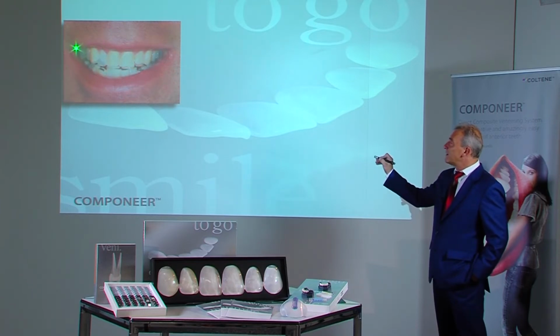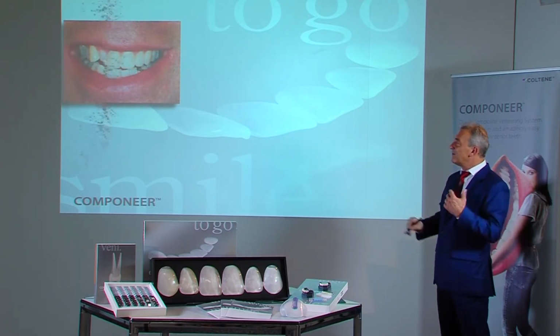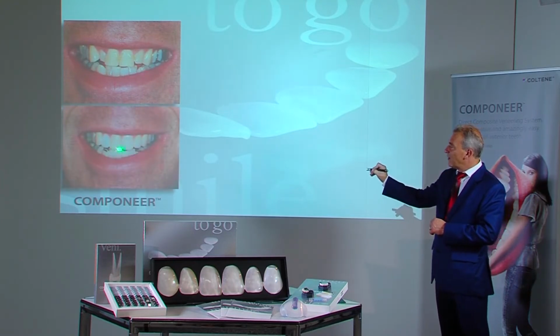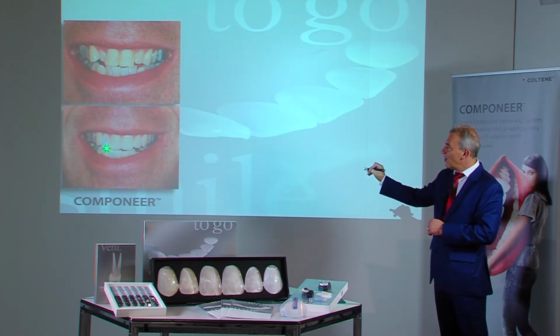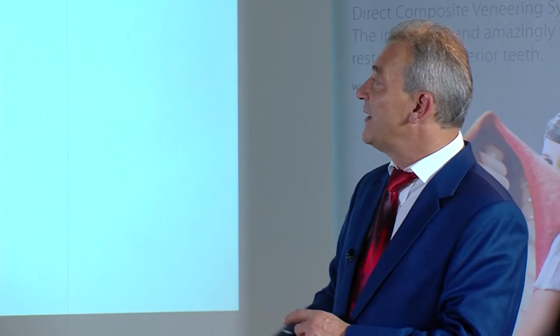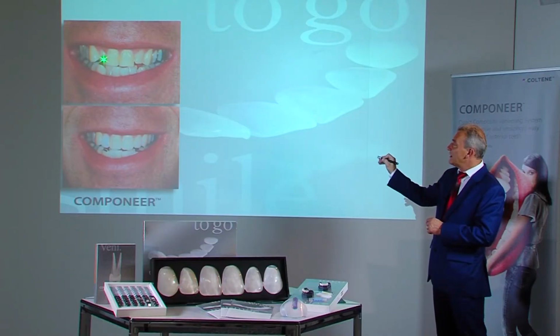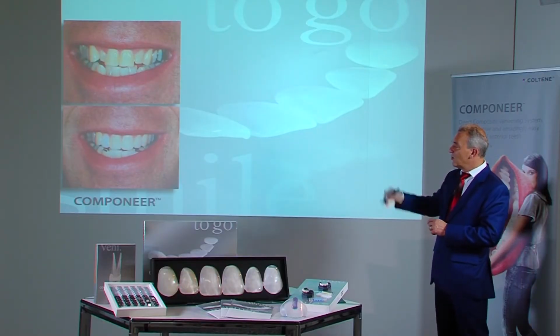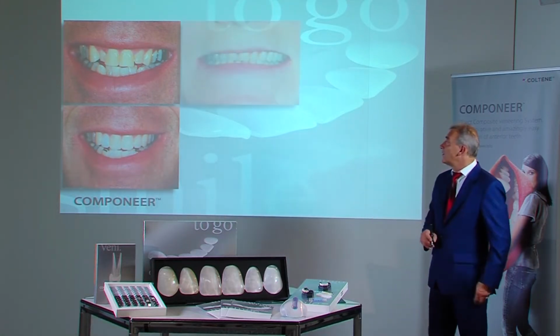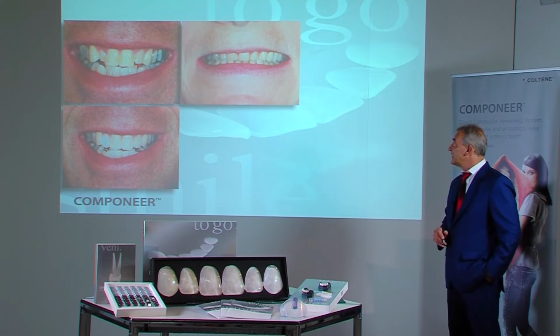Harmony is achieved by moving the incisors somewhat to the front. And at this moment, one can see that the lower jaw requires a little bit of grinding. This means the incisal edges of the lower incisor need to be polished slightly in order to shift the lateral incisor into the right occlusion, so that the overjet is corrected in the end.